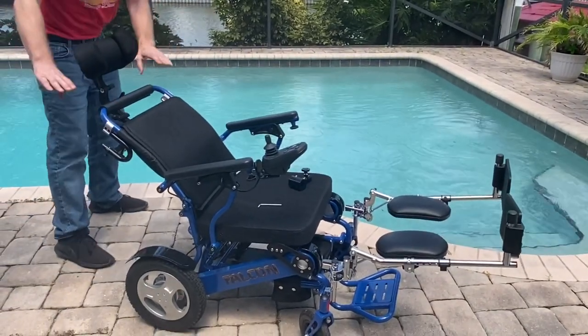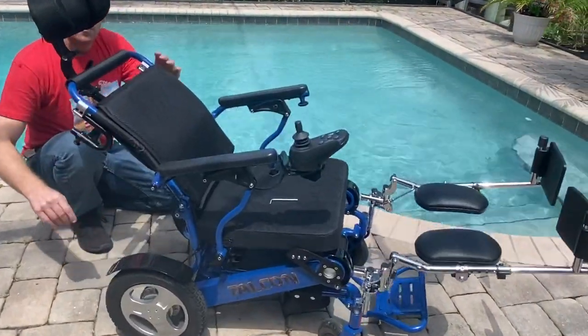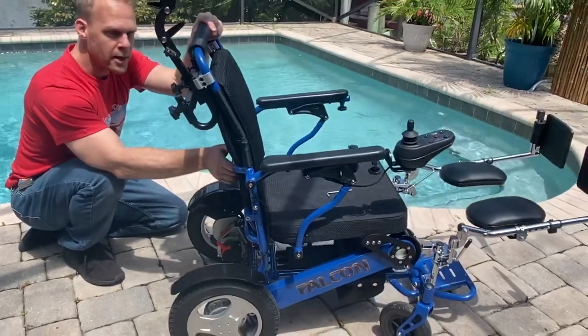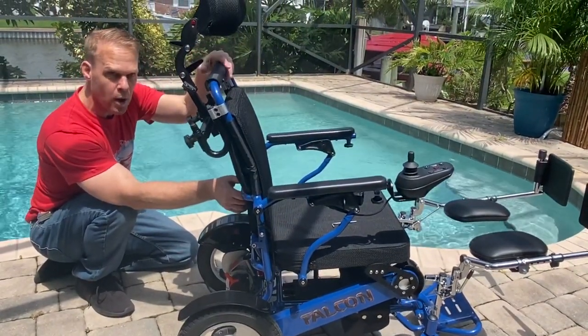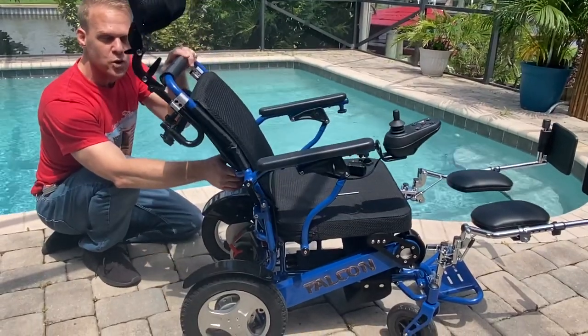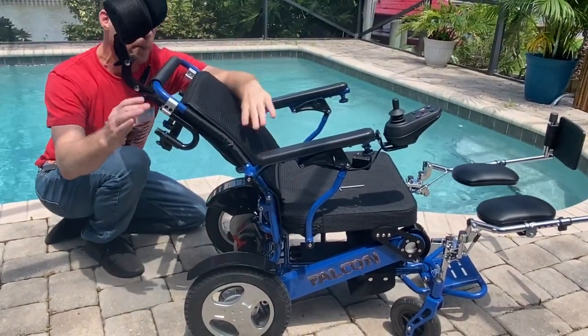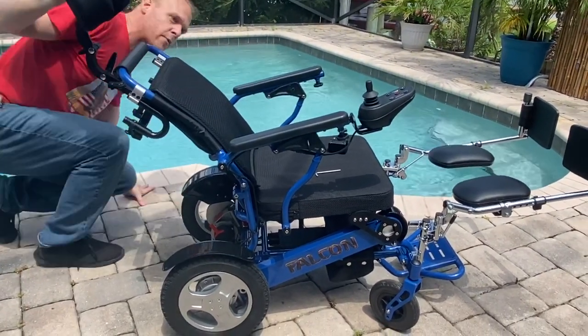The Falcon is, in many ways, a one-of-a-kind chair. Let's take a look at the armrests. This is one of the only ergonomic reclining power folding wheelchairs on the market, if not the only one. The armrests actually elevate, taking the pressure off the lumbar and off the person's shoulders when sitting in the chair, to accommodate a chair with a headrest.